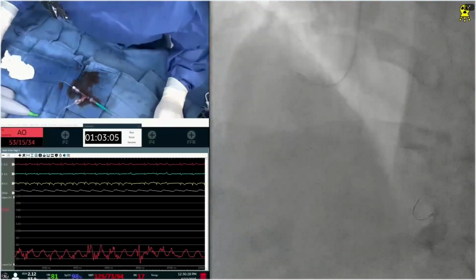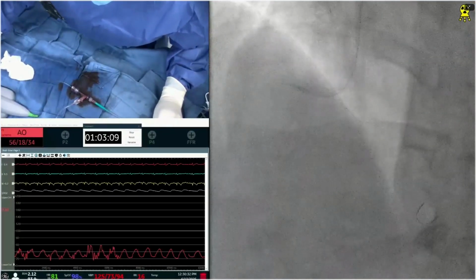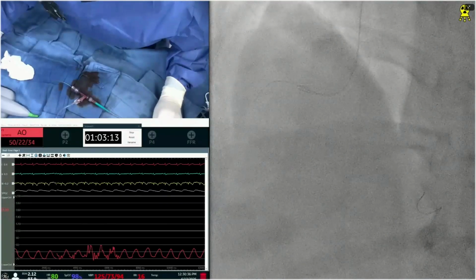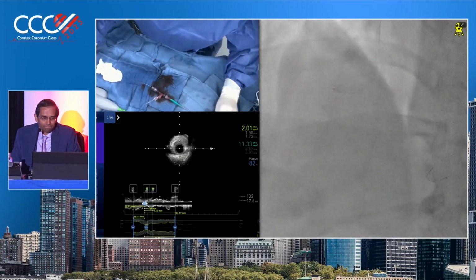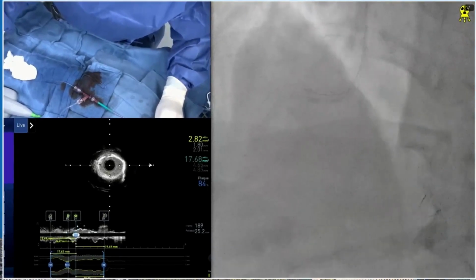Deepak? Likewise, when the device came out I was somewhat enthusiastic because it was just easy to set up and control everything right on the table, but at this point, if I'm going to do atherectomy, typically we just go with Rota. John? I would say nationally it's at least 2-to-1 in favor of Rota.